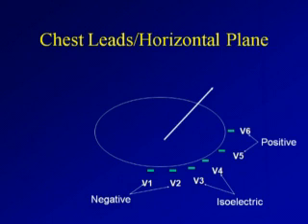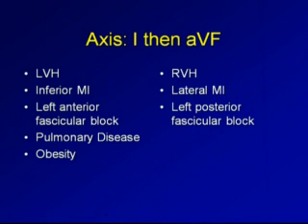...or V2 or V3, slicing the body in half, looking towards my exploring lead or my chest lead. Now we could go through polar coordinates and describe what happens in the chest leads. However, that's not been as well developed and it's not as useful clinically in describing the EKG. So to start with, mean electrical axis.